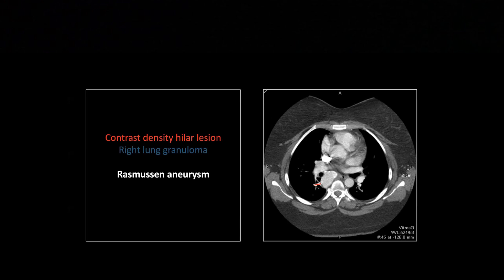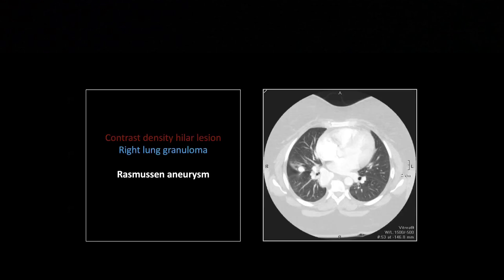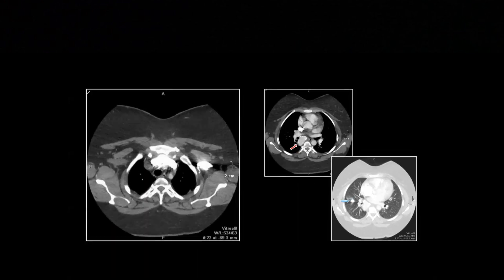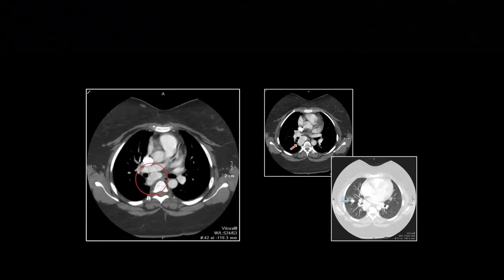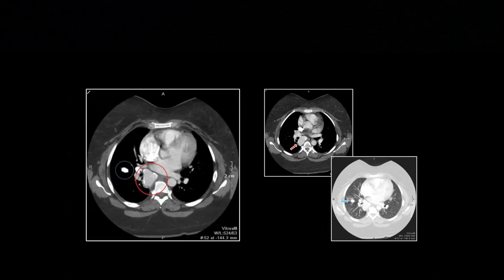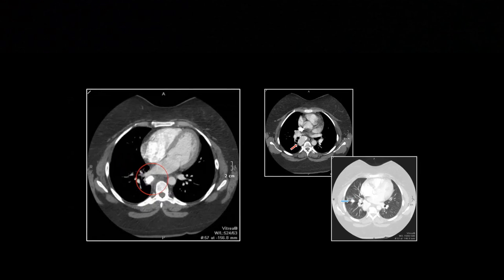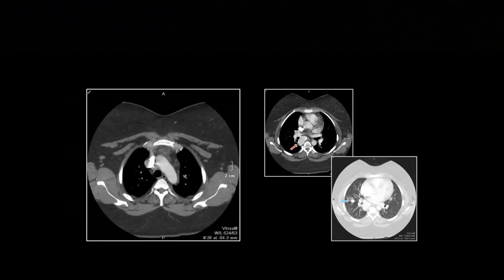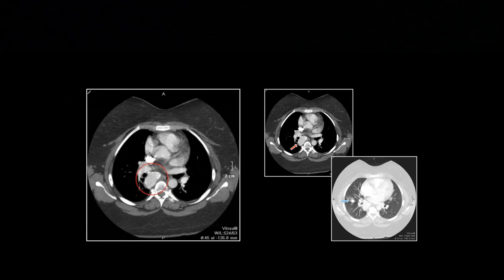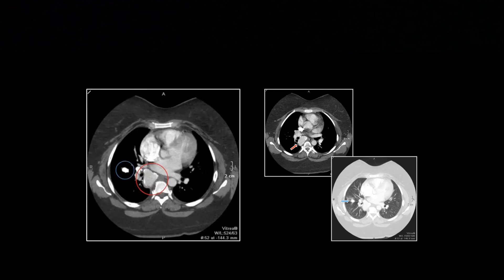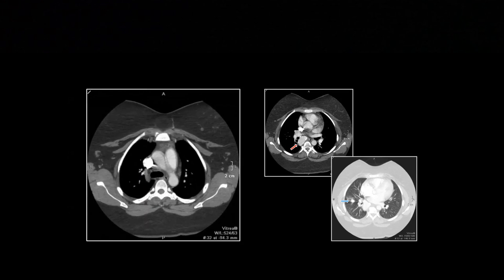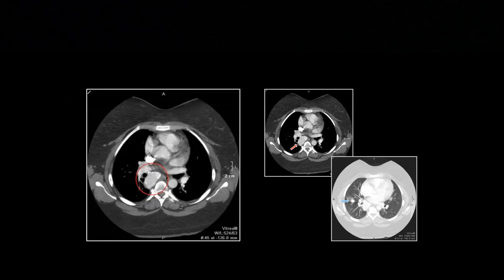This one was made a little easier because there is a dense calcification here, typical of a Ranke complex. There are hilar calcifications as well. So previous exposure to tuberculosis plus this finding, this peripherally calcified collection of contrast, that spells Rasmussen aneurysm, which is specifically a pulmonary artery aneurysm arising from tuberculosis infection.